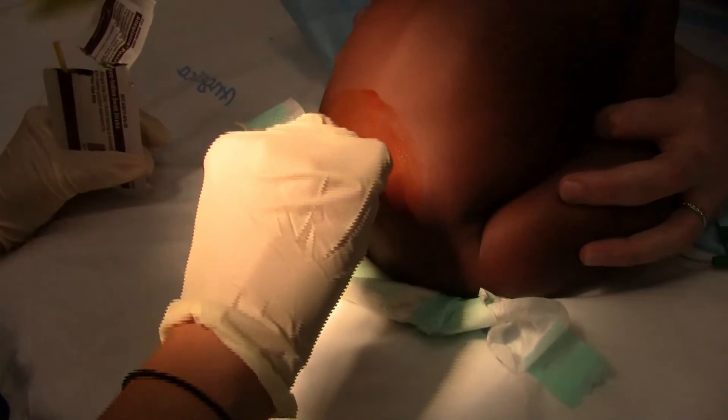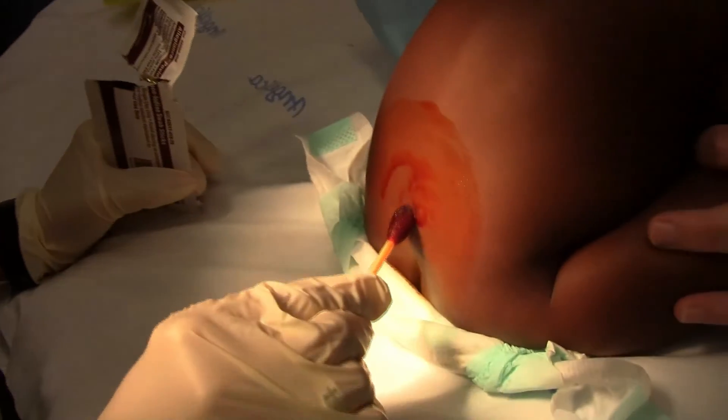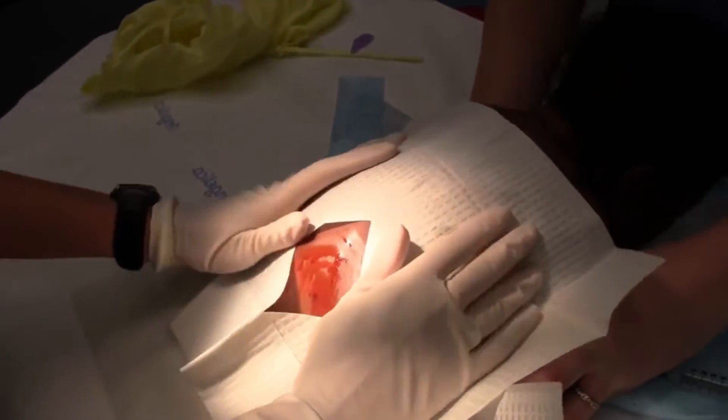Allow the antiseptic solution to dry thoroughly before proceeding, as many antiseptics, like chlorhexidine, achieve maximum germicidal effect when allowed to dry. After the solution has dried, sterile drapes are to be placed around the puncture site, allowing a sterile environment to perform the procedure.